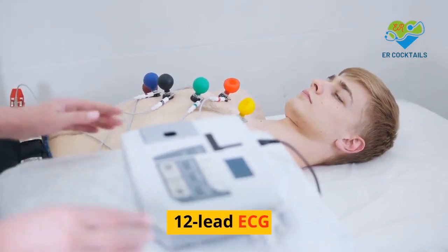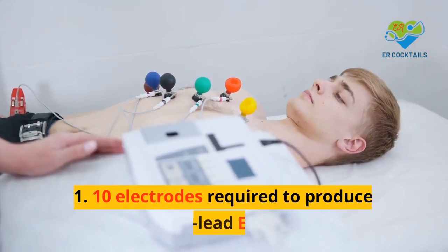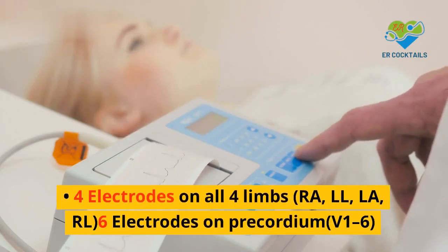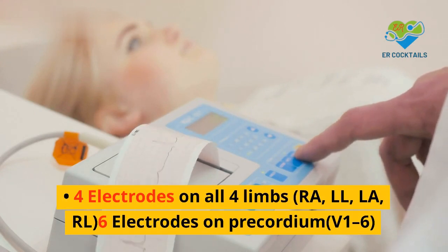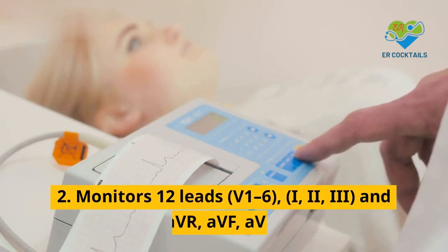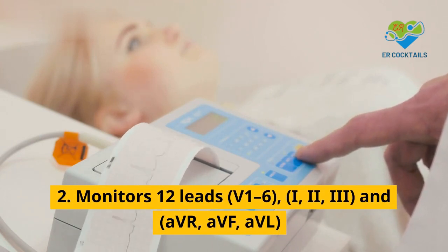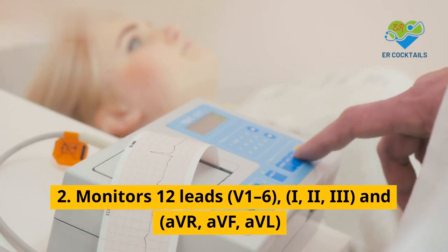12-lead ECG. 1. 10 electrodes are required to produce a 12-lead ECG: 4 electrodes on all 4 limbs, RA, LL, LA, RL, and 6 electrodes on the precordium, V1 to V6. 2. It monitors 12 leads: V1 to V6, I, II, III, and aVR, aVF, aVL.